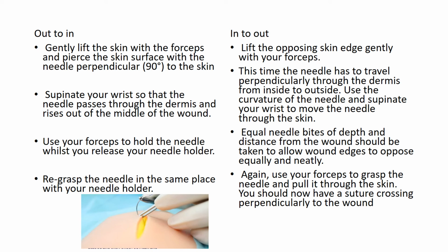Then you use the in to out principle to reintroduce the needle on the opposite side of the wound edges. So in to out, this is where you lift the opposing skin edge gently with your forceps.